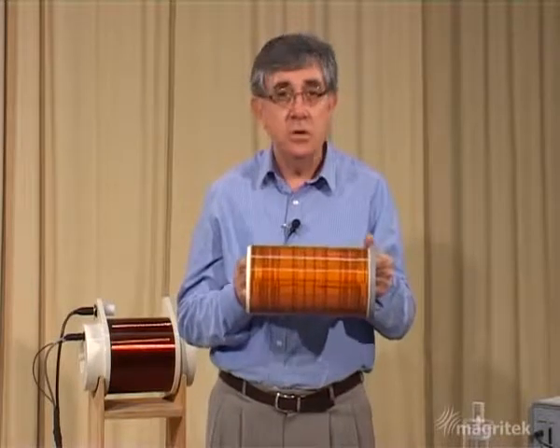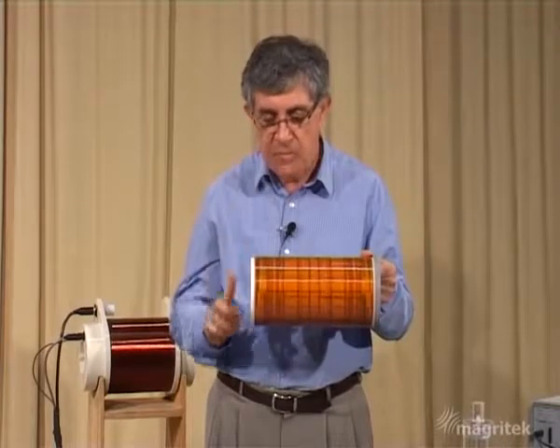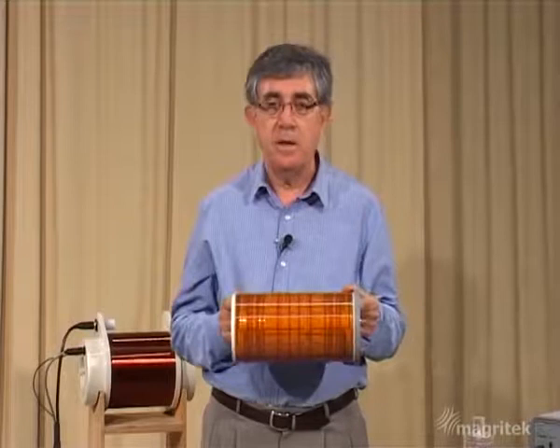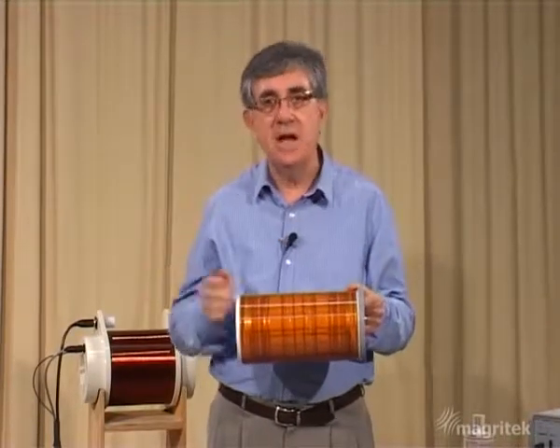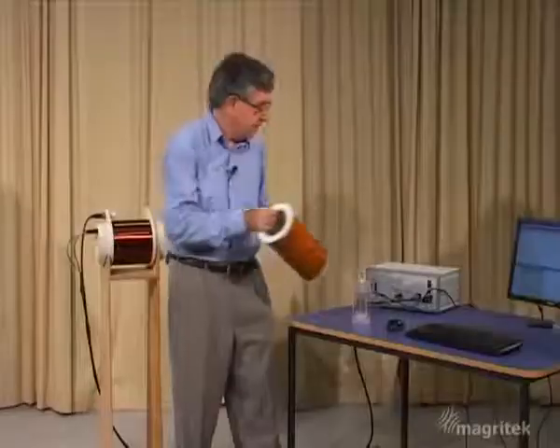So the idea is to use these gradient coils to produce the variation of magnetic field along the Z axis in combination with a spin echo experiment. We will see the spins come into phase and then back out of phase again under the influence of that magnetic field gradient. So now we're going to do the MRI experiment.